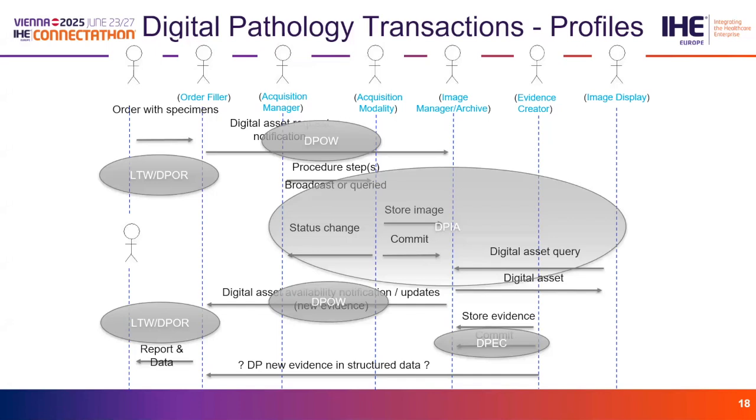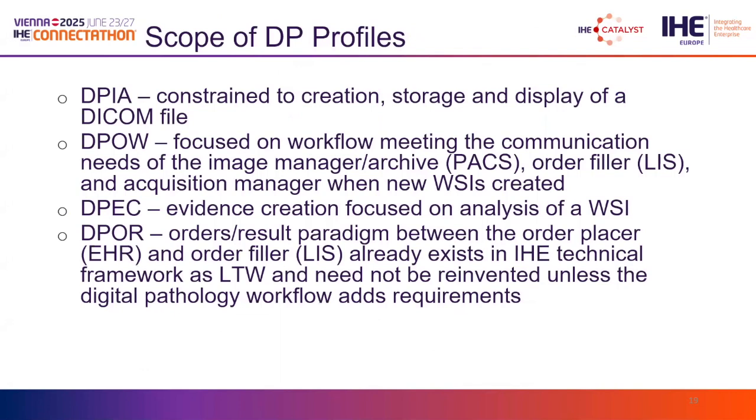The final profile that's listed there is the digital pathology evidence creation profile that speaks to the digital analytics and AI and machine learning data outputs that might be generated from machine interpretation of a digital image or human interaction with an image, for example, to identify a region of interest and then have some type of analysis performed on it. And I think with that, we've covered the profiles that we want to work on for the near future.